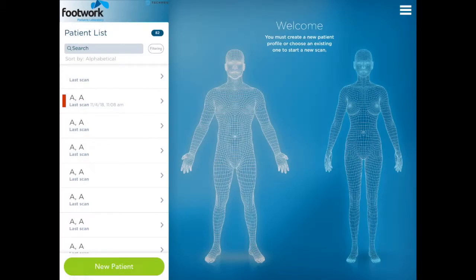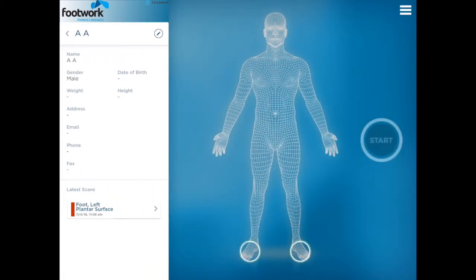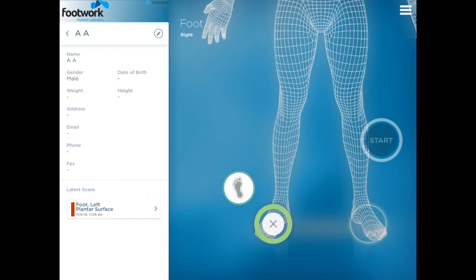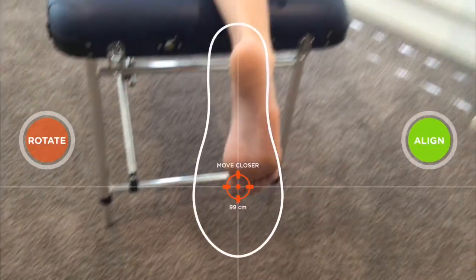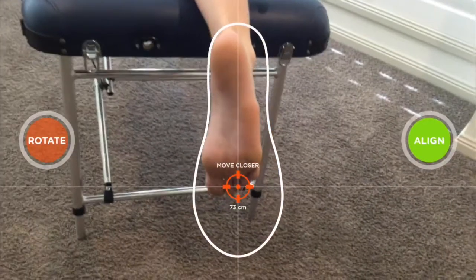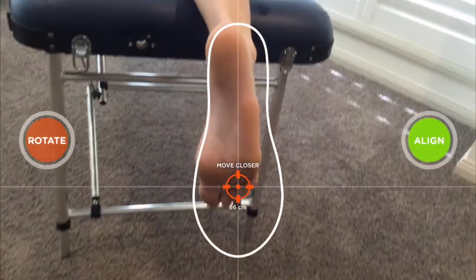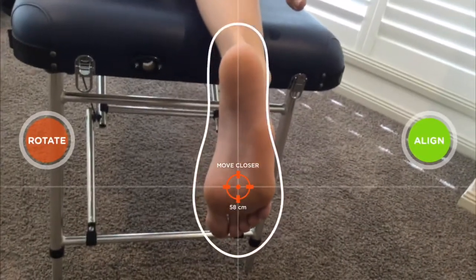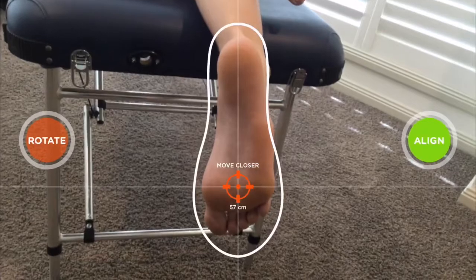If you then open up a scanning window, what you'll notice is that the new bounding box now comprises the shape of a foot, and you can rotate this image if required using the red rotate button on the left.